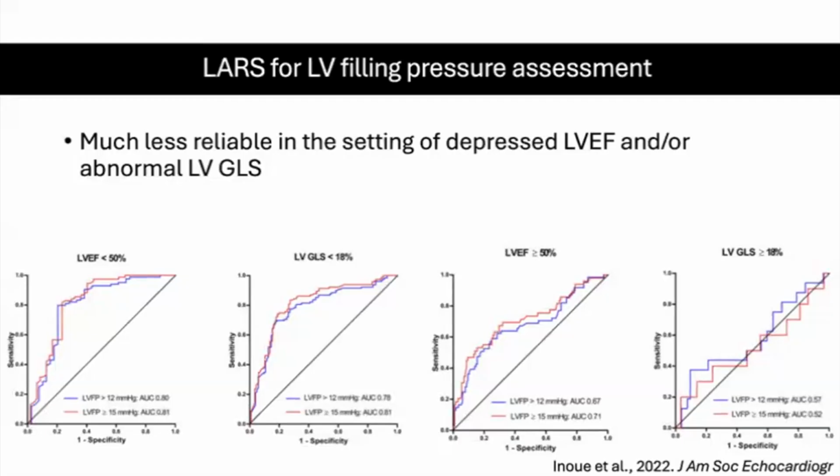And I think a lot of people find this disappointing because it means although there's some promise from what we've seen so far to the applicability of left atrial reservoir strain in diastolic function assessment, this doesn't get us that much closer to identifying those HFpEFers who have, on first glance, a structurally normal appearing myocardium, and doesn't get us much closer to understanding their physiology and their LV stiffness and relaxation patterns than the other conventional variables.